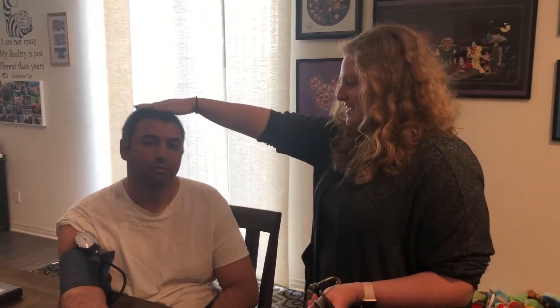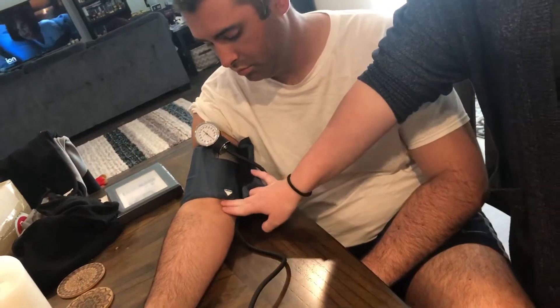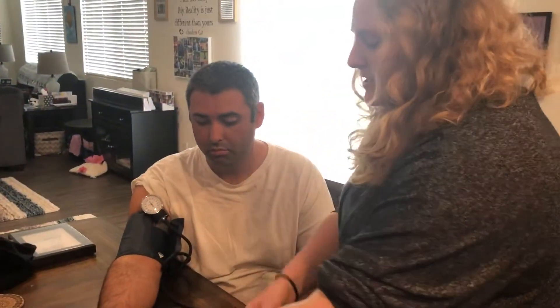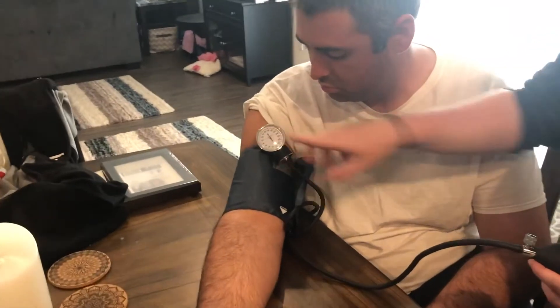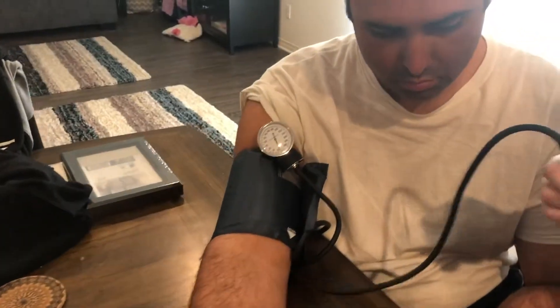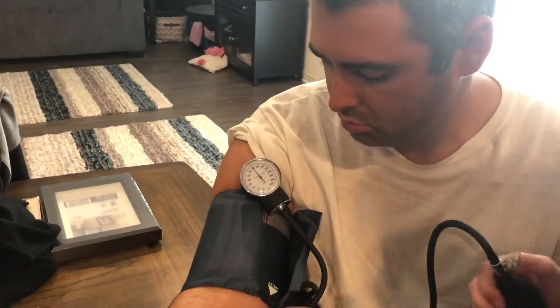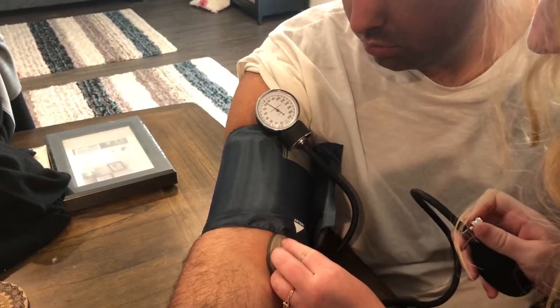So the first thing we're gonna do with my test subject Christian is the blood pressure. With the blood pressure you want to line it up right here where the brachial artery is. You're gonna line up right above the brachial artery, and then I'm gonna have my stethoscope so I can listen to the brachial artery as we pump up the blood pressure cuff. I'm gonna go up to about 160 and then go ahead and put my stethoscope right here and listen and slowly release air.